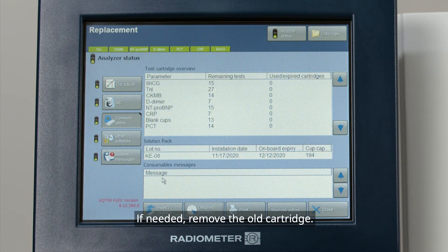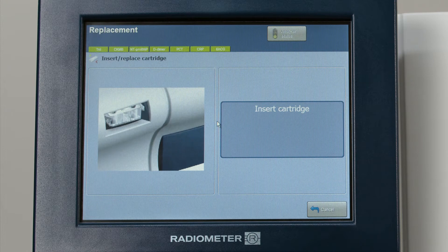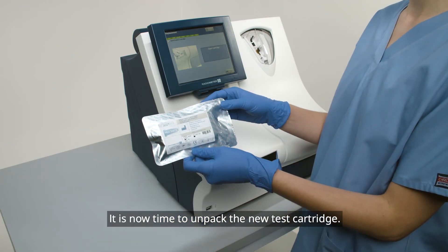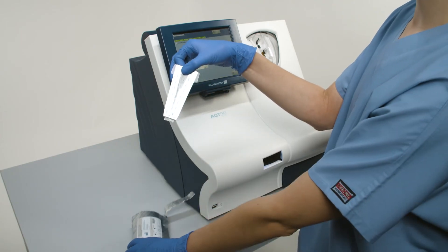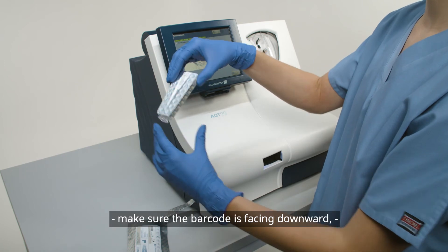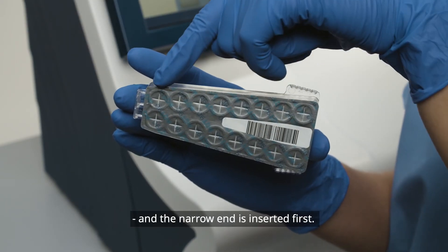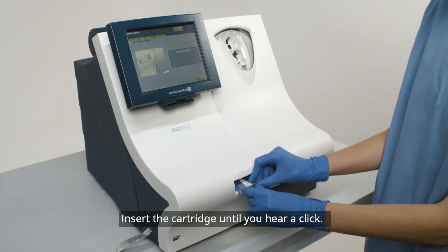If needed, remove the old cartridge. It is now time to unpack the new test cartridge. Before inserting the cartridge, make sure the barcode is facing downward and the narrow end is inserted first. Insert the cartridge until you hear a click.